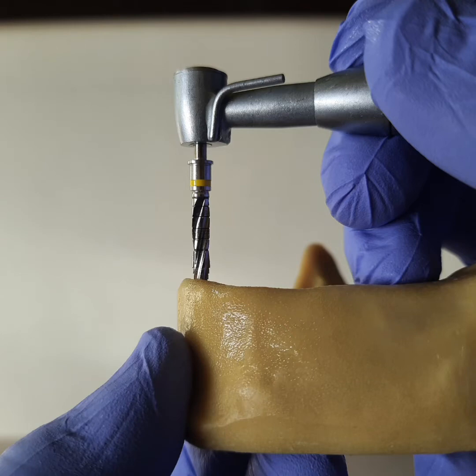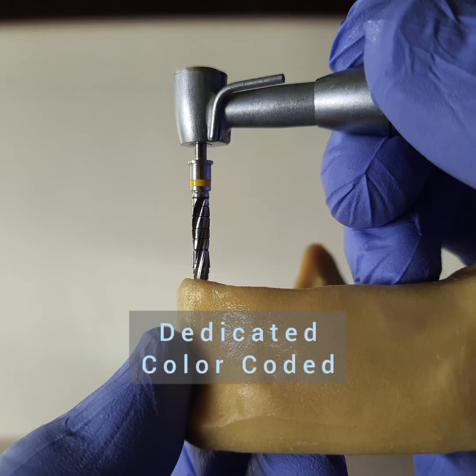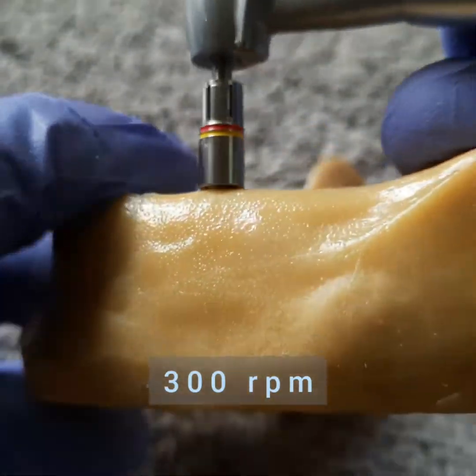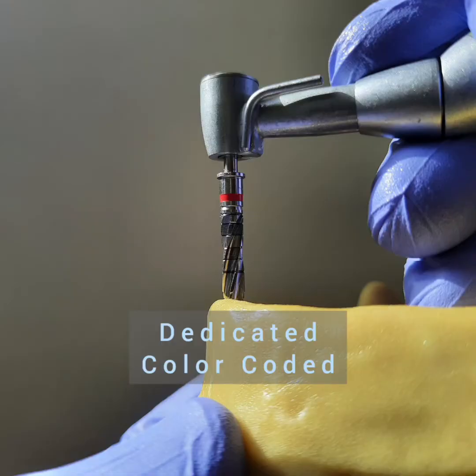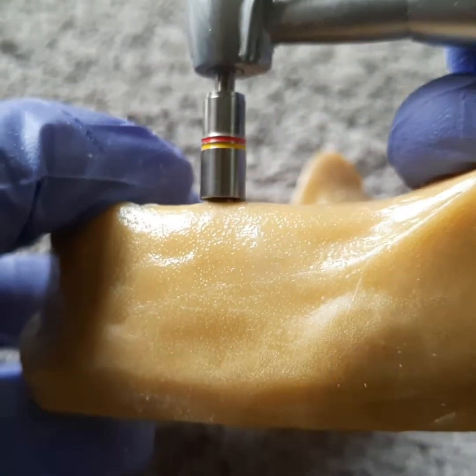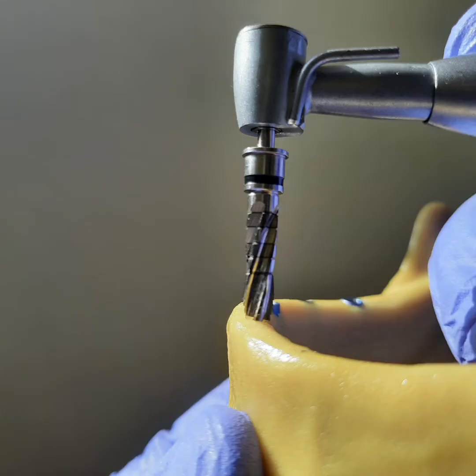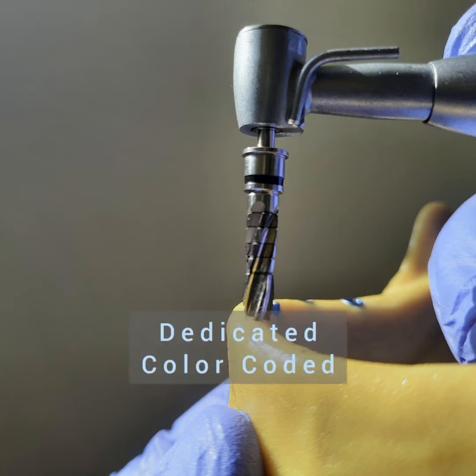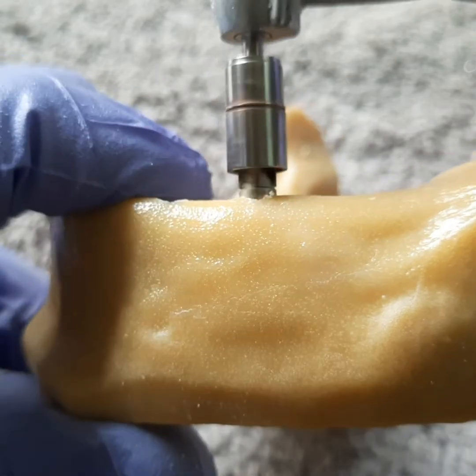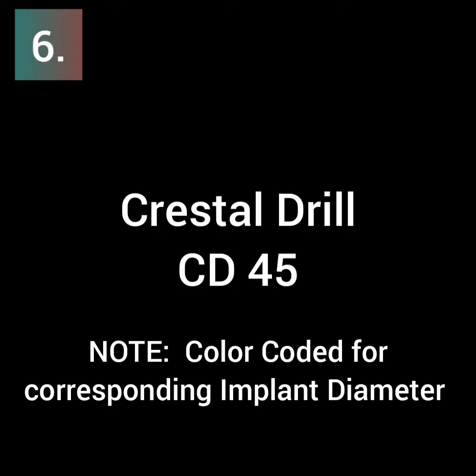The progressive sky drills are used tube-in-tube to widen the osteotomy. The 3.5 dia drill is employed for both the orange-colored Narrow Sky or yellow-colored regular shoulder Blue Sky implants. Up next, the 4.0 dia drill — the convenience and relative ease for the surgeon is self-evident. Remember that the rpm drops to 300. The subsequent 4.5 dia drill, the final drill for this series, is again run at a slow speed of 300 rpm and with controlled depth.